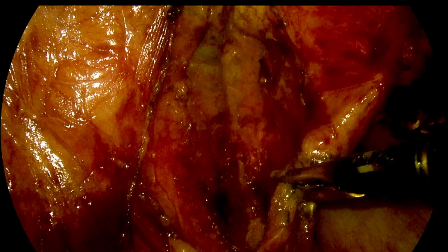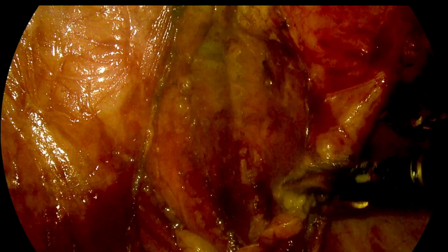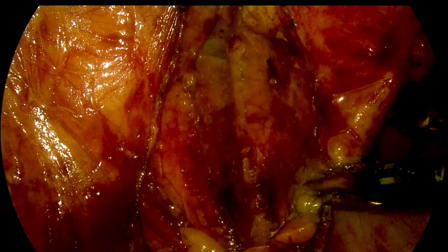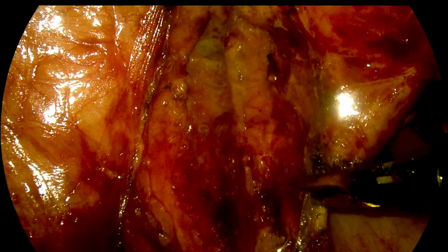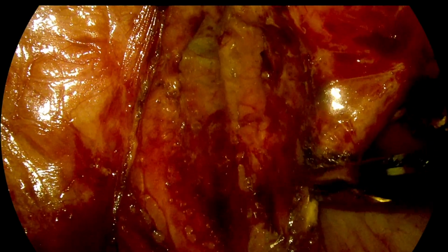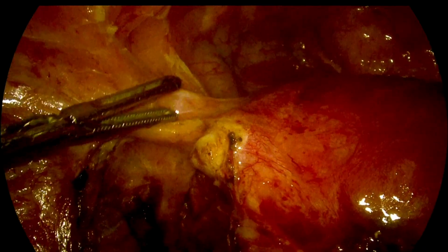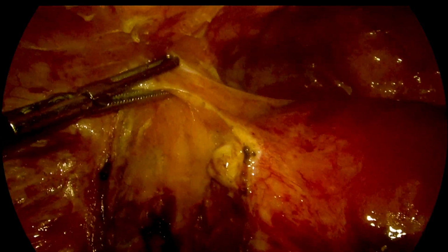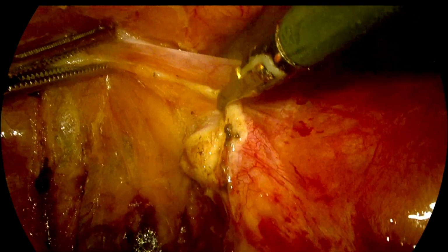So once we identify the ureter, now it is easy and safer to divide this band of tissue between the uterus and the left pelvic wall. Now we can further continue the dissection towards the uterine vessels. So that is the uterovesical fold of peritoneum. It is advanced near to the round ligament on the left side.